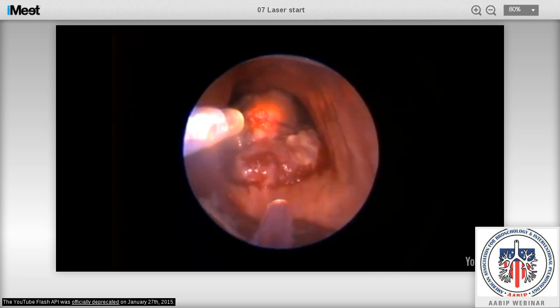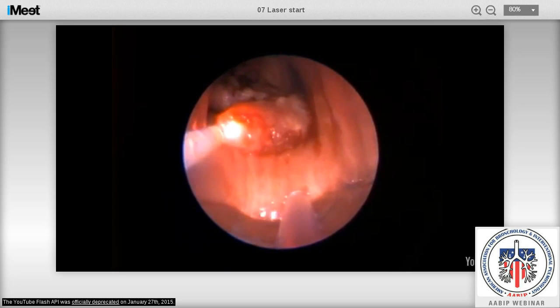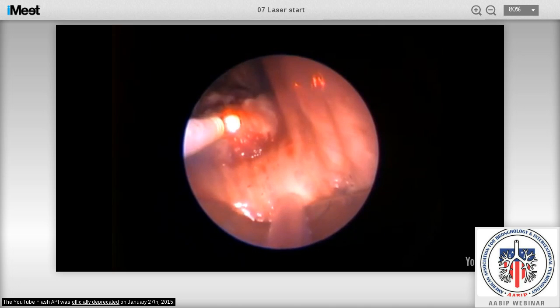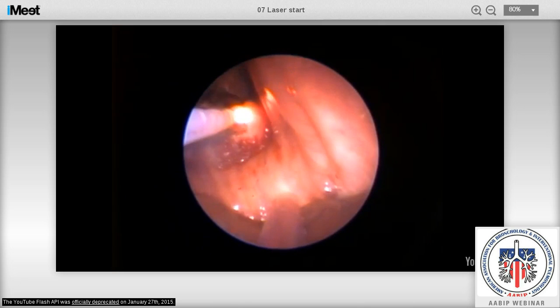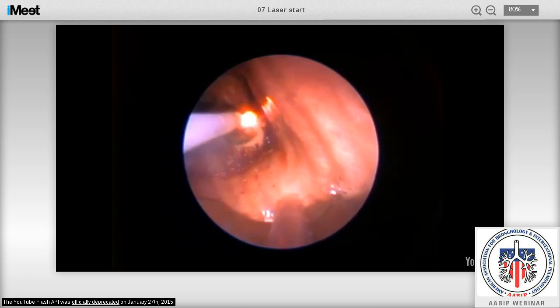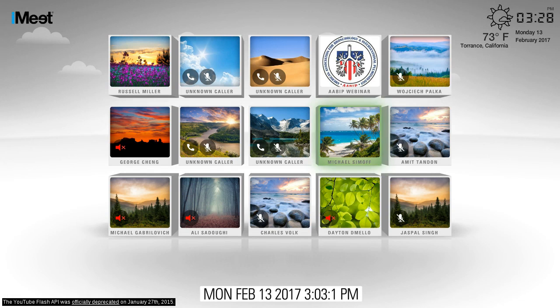For those who have never seen laser used: we maintain suction in the airway to suction off secretions and importantly the smoke created by the laser's photocoagulative effects. Photodesiccation generates even more smoke. You can see how we cause the surface to be photodesiccated.